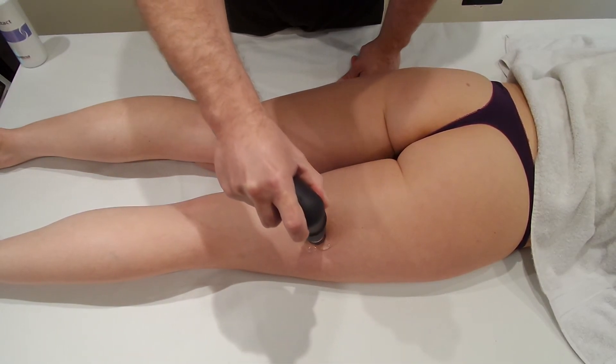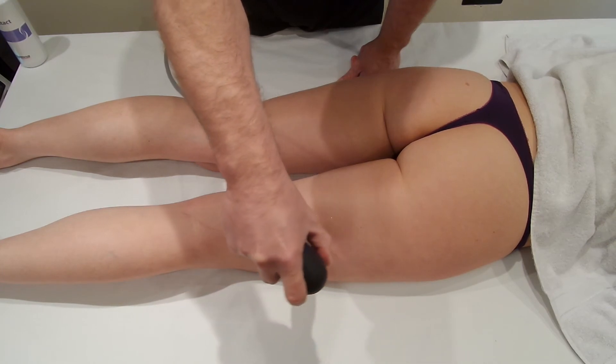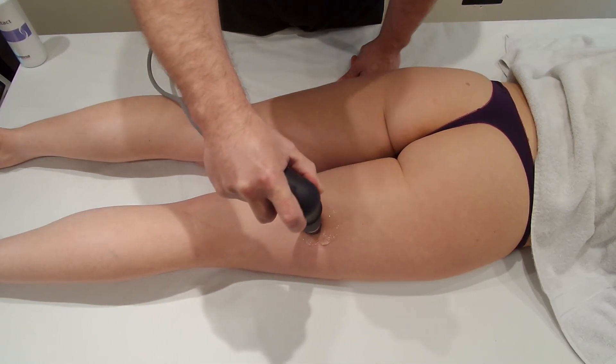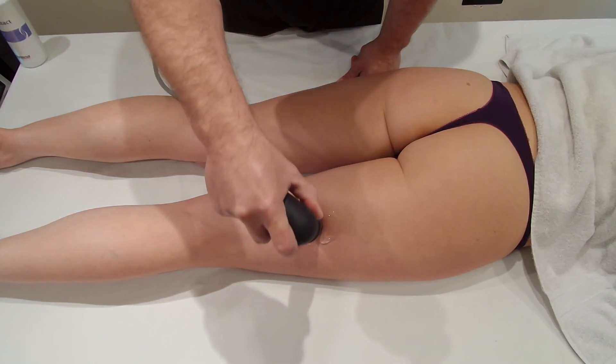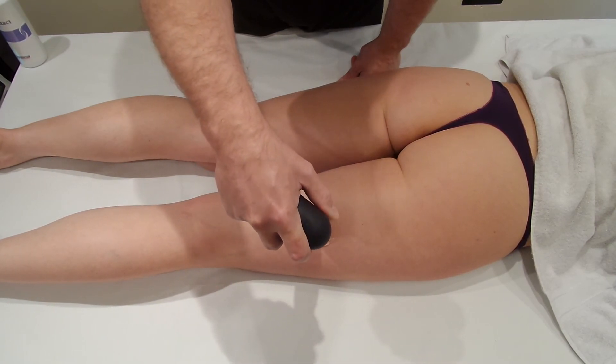If you're imagining you may have trigger points in bicep femoris, semimembranosis, and semitendinosis, you may well have to stop and move — it's a bit of a big move to go across the thigh with the shockwave running. So come across here with multiple angles until you ease off the trigger points.